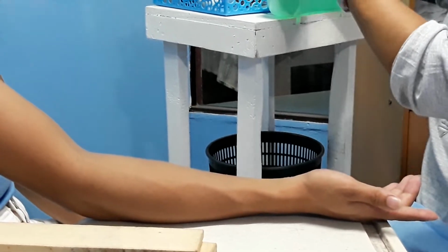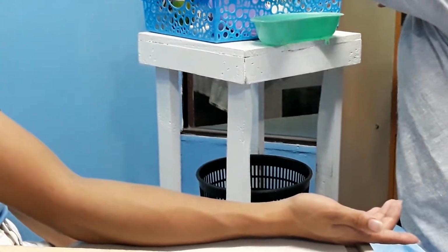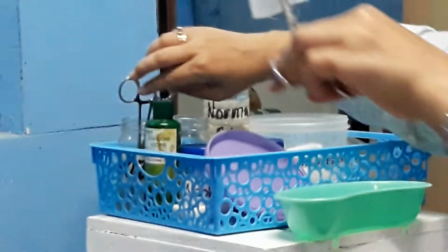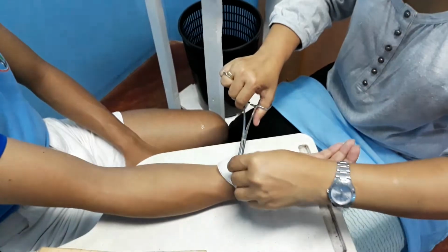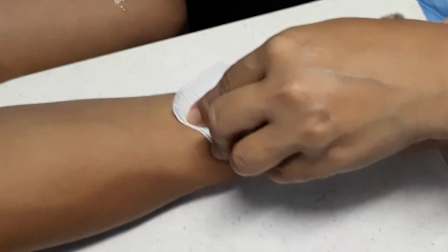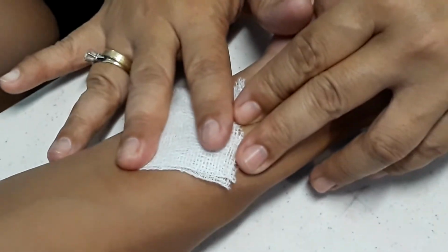You have to get an OS or any piece of clean cloth, using your picking forceps. If you're going to get your OS, first you use the picking forceps, followed by your working forceps. Why? Because you have to remember that this tray here is a sterile tray. Then you apply the OS, or if you have a cloth, you may apply it directly to the wound. And of course, you have to apply pressure like this. Applying pressure helps in stopping your bleeding.